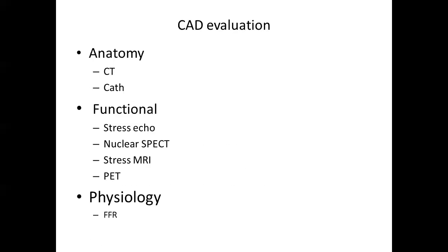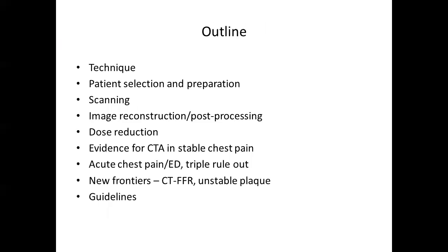I like to think of it this way, and then each of you during training is going to get your own biases about preferring this test over that test, and that's fine. There's no wrong answer here. But there are certain nuances to which patient works better with which one. How I really look at CT is it's like a poor man's cath. So you think a patient needs a cath, but you think it's going to be normal, that's going to be a CT patient. And you'll figure out over time which way you want to go with particular patients.